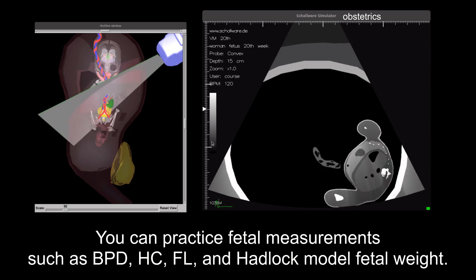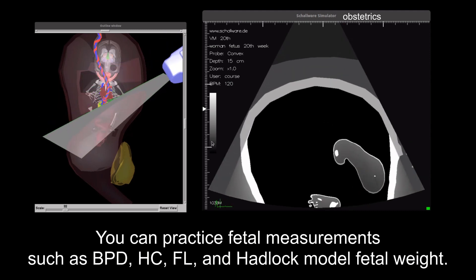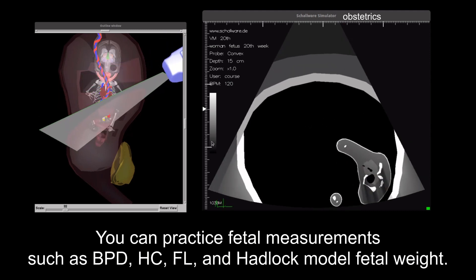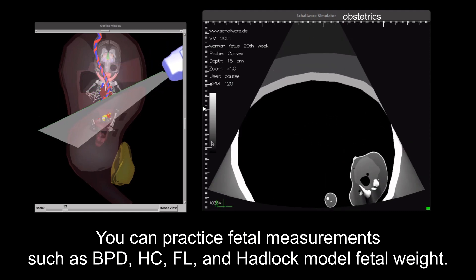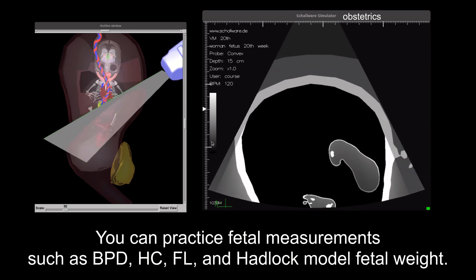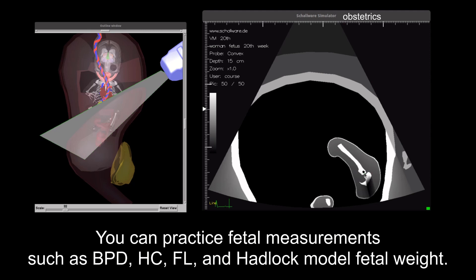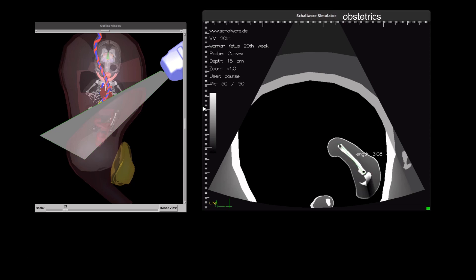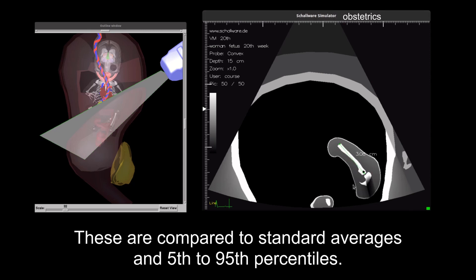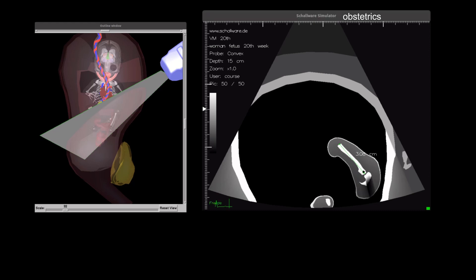Students can practice fetal measurements such as BPD, AC, HC, FL, and Hadlock model fetal weight. These are compared to standard averages and 5th to 95th percentiles.